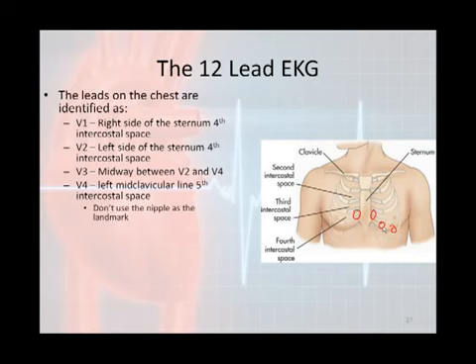Please do not use the nipple as a landmark, because not all nipples on the human body are placed in the exact same spot. Older people are going to have different nipple locations than younger people, and if women have any kind of breast augmentation done, then the nipples can pretty much end up in any direction. So please do not use tissue as a landmark. Use the clavicle, the midclavicular line, as the actual landmark.